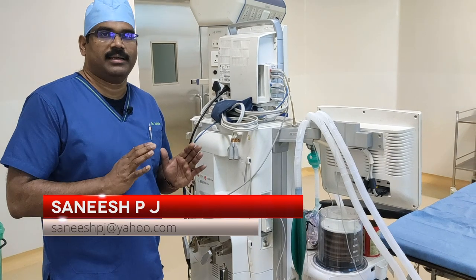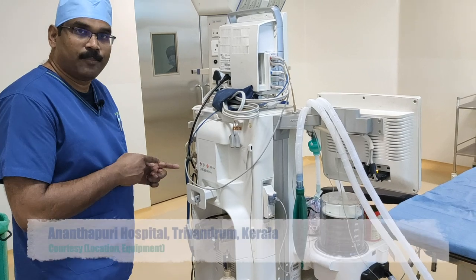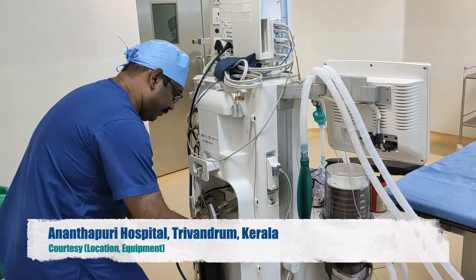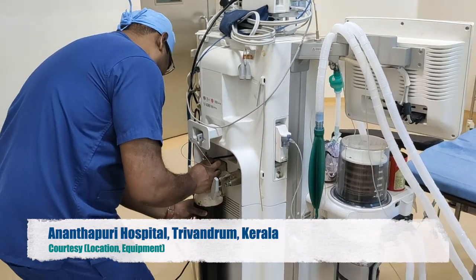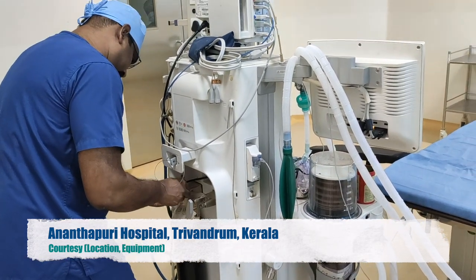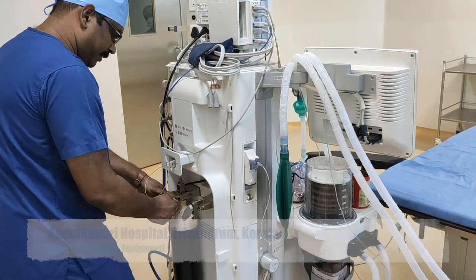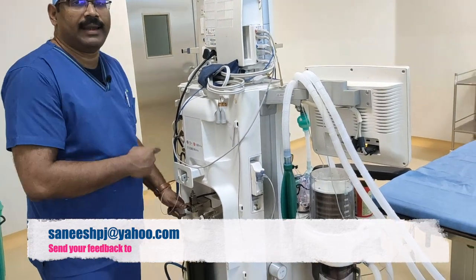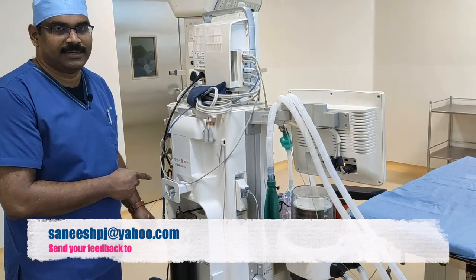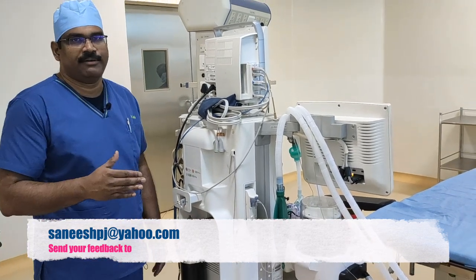Having understood the pin index safety system, let's mount this cylinder back onto the proper — that is, oxygen — hanger yoke assembly. Now I can get a perfect seal and I can register flow in the oxygen flow meter and check the pressure in the cylinder pressure gauge. That's the pin index safety system. Leaving you on a positive note, it's me Dr. Sainish signing off.